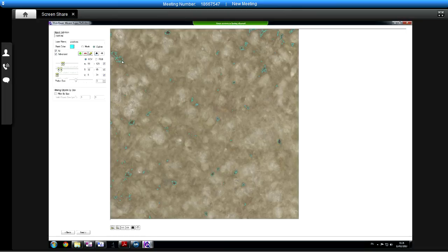So colour-wise, you'd mark that as a positive, I guess, but it's not actually, obviously, is it? Yeah, no. Oops, clicked the wrong thing there, so I'll just undo that. So let's just go back a step a moment. And the other thing I notice here is we're getting quite jaggedy edges, which isn't very neat and tidy, whereas our real positives are a bit smoother and rounder, aren't they?